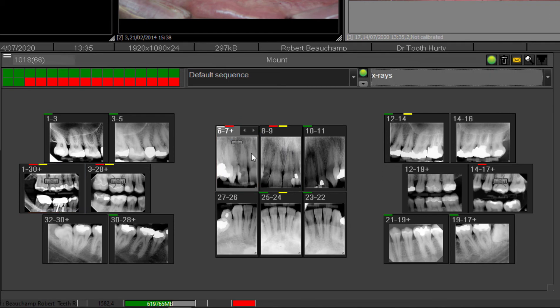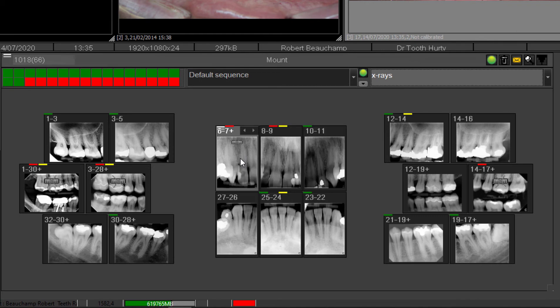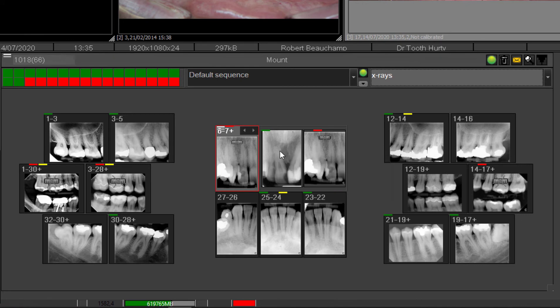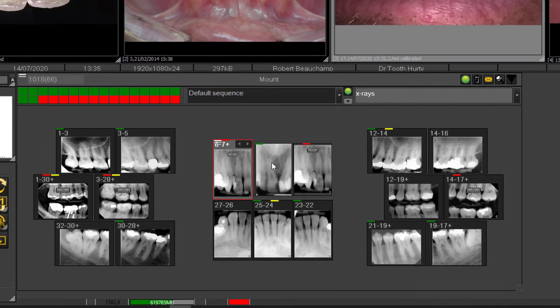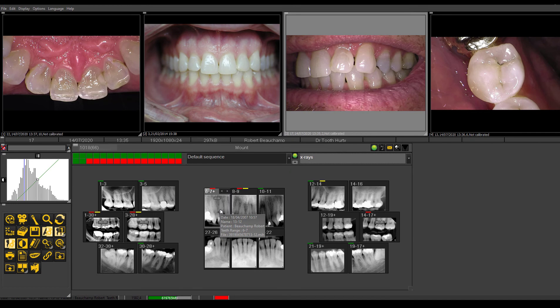And if you highlight that x-ray and left-mouse-click for a couple of seconds, it will tile out to the right and they will all be there chronologically. You can see the date and time of each image taken. This is where you can easily view and see the images.